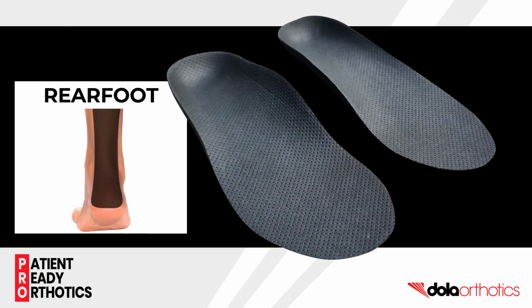The Rearfoot patient-ready orthotic is designed for patients showing signs and symptoms of pathomechanics of the posterior foot and leg and impaired sagittal plane function of the ankle. This video will help you identify which of your patients will benefit from adding the Rearfoot orthotic to their treatment plan.